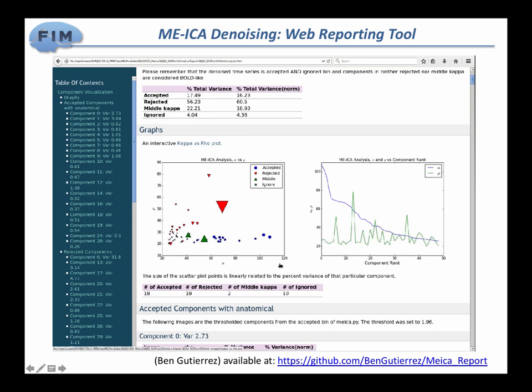And if you see any problems, I mean, there is no reason why you couldn't say, well, these components should have been removed, and you could actually remove them. And when you write your paper, you say clearly that there was a mistake with one component, this is the component, and I'm removing it, and that shouldn't be a problem.